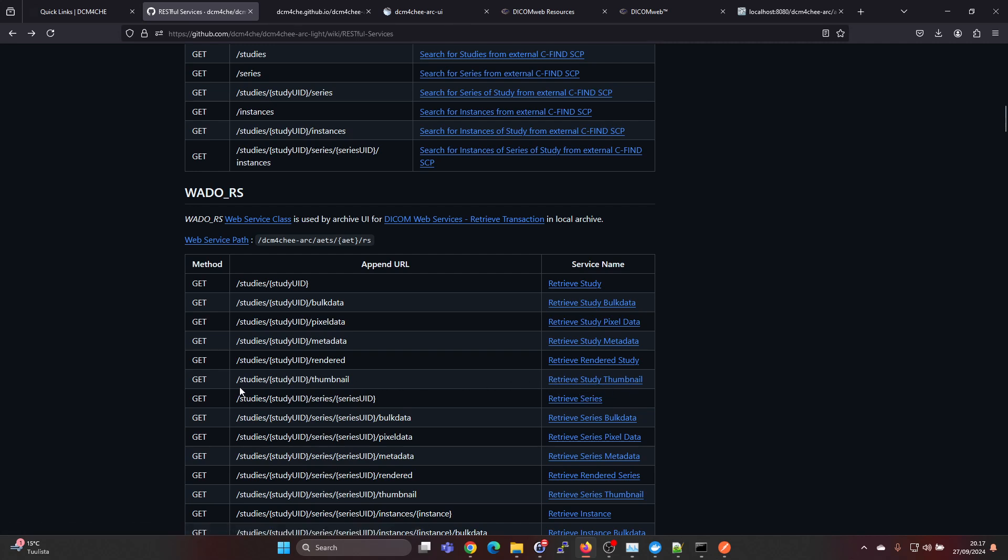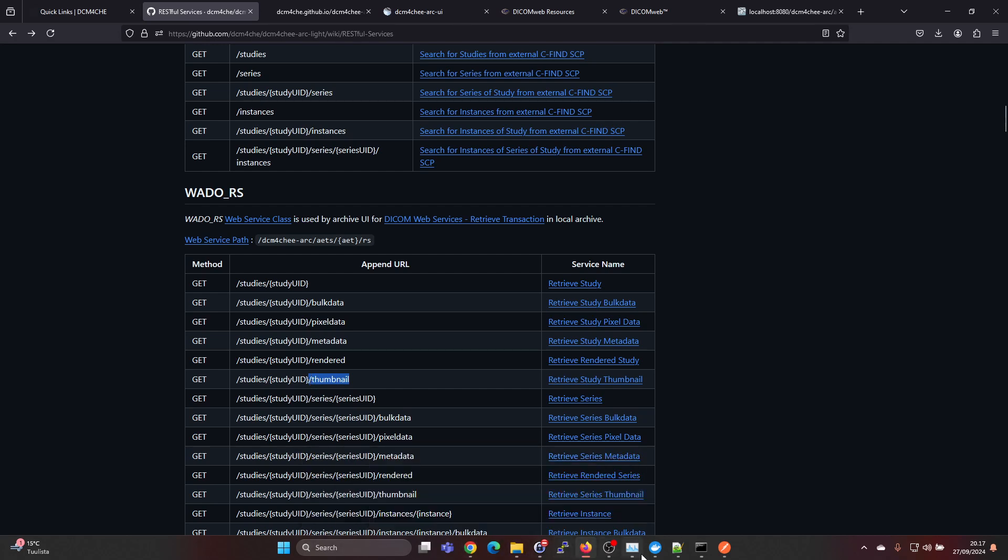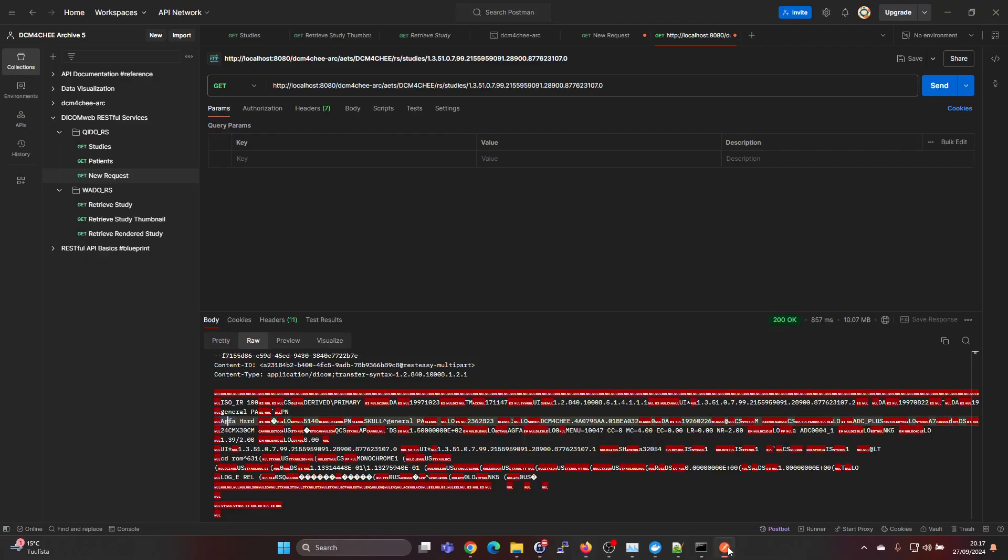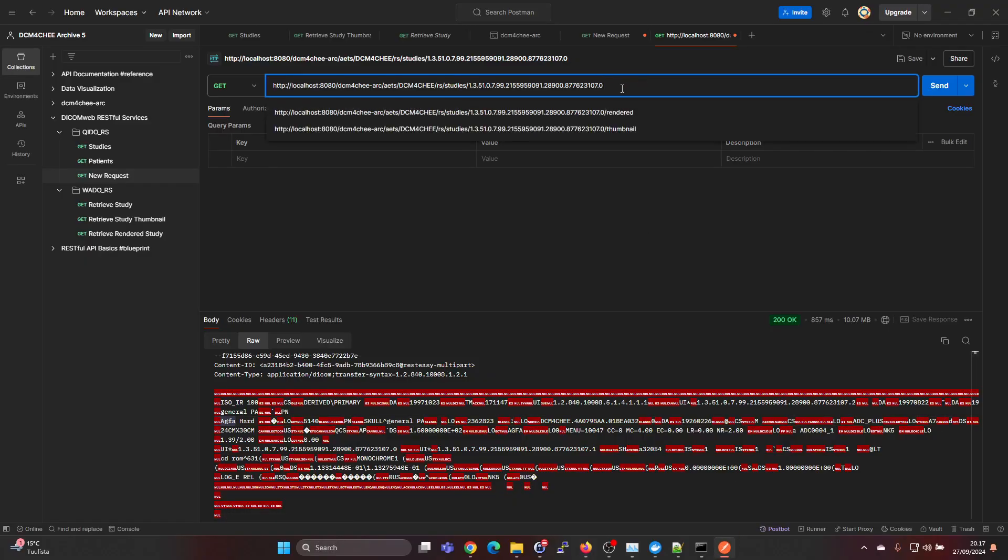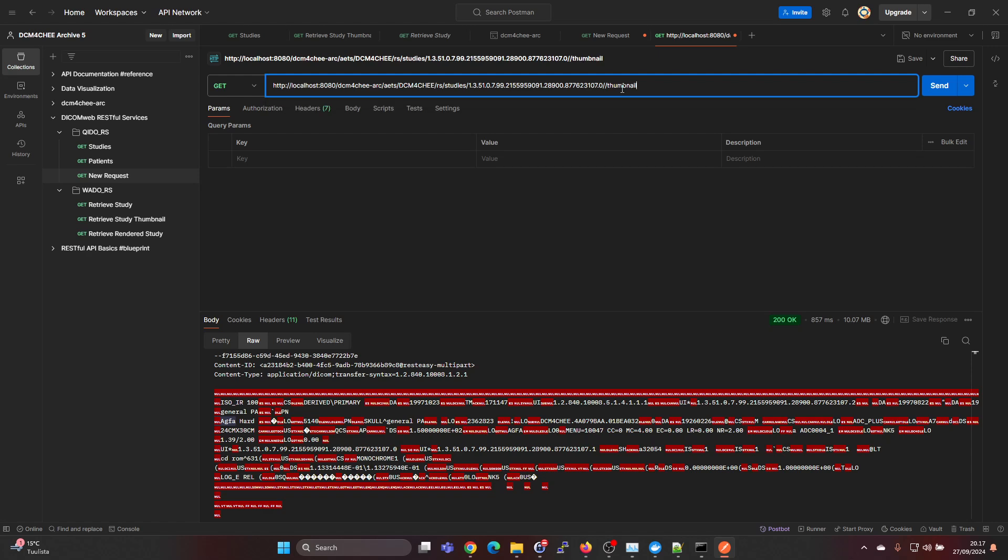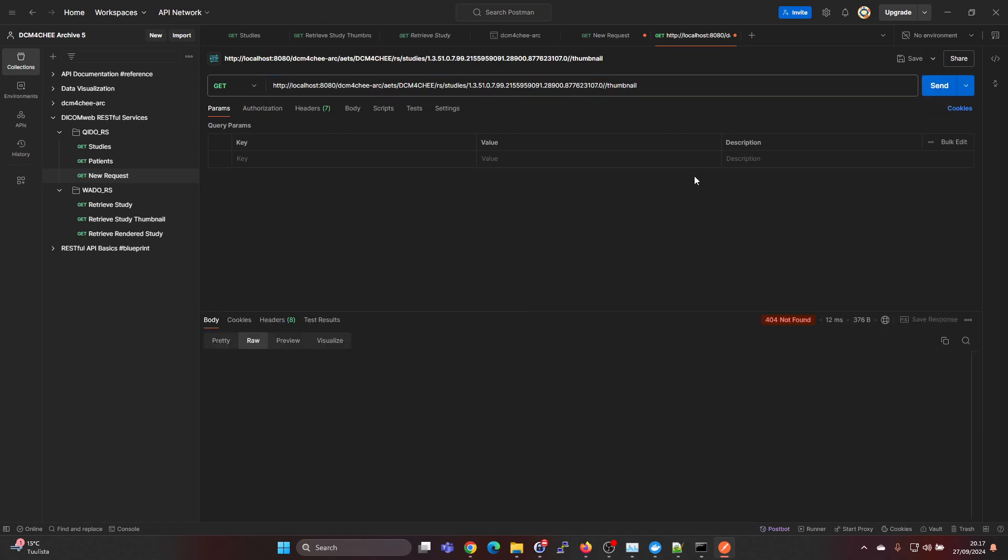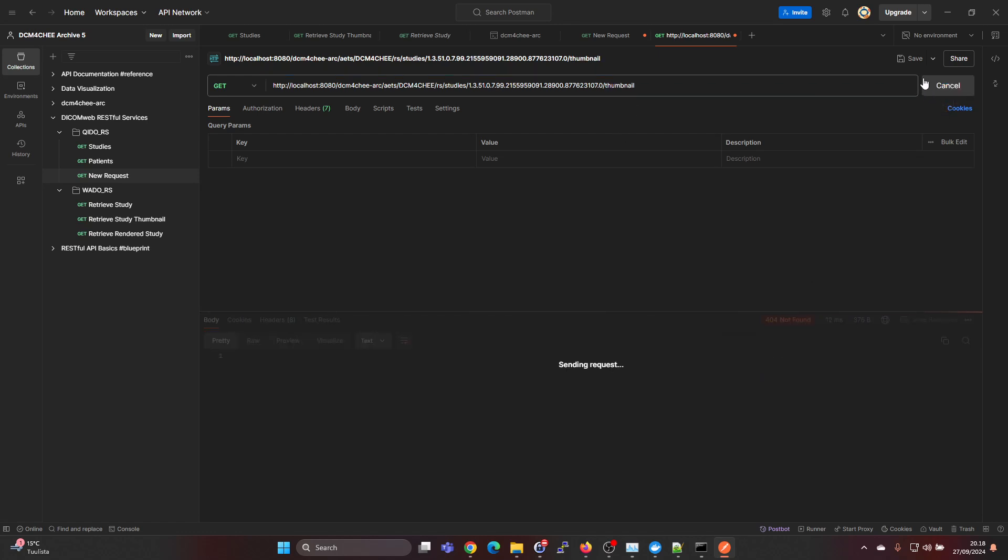If we give study UID and then add slash thumbnail, we should get the thumbnail. If we go back to Postman here and add slash thumbnail and press on send, okay I had two slashes, that's why we got the error.